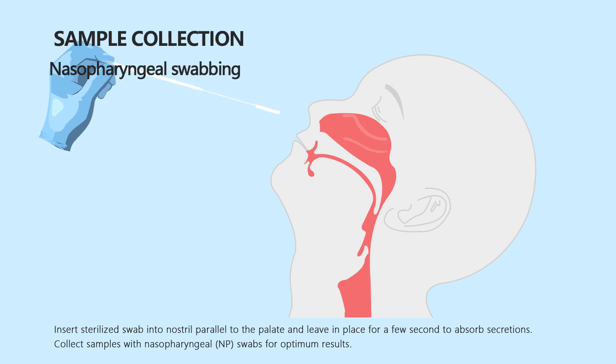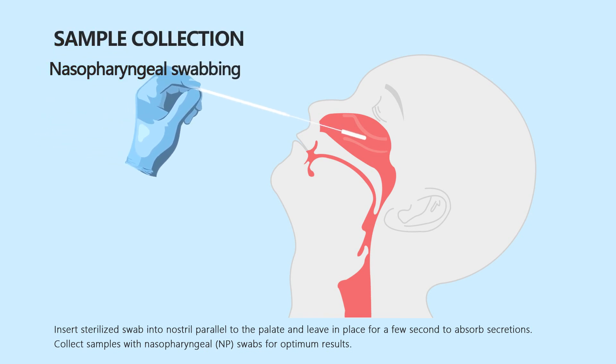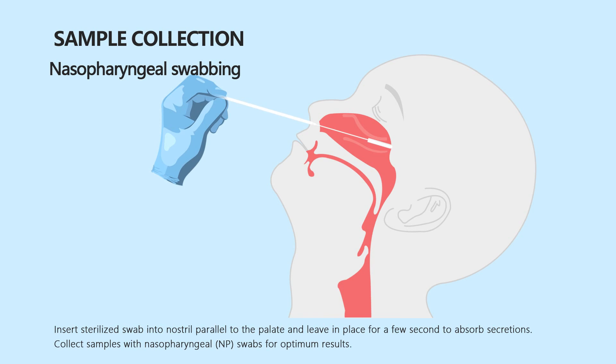Insert the sterilized swab into the nostril parallel to the palate and leave in place for a few seconds to absorb secretions. Collect samples with nasopharyngeal swabs for optimum results.